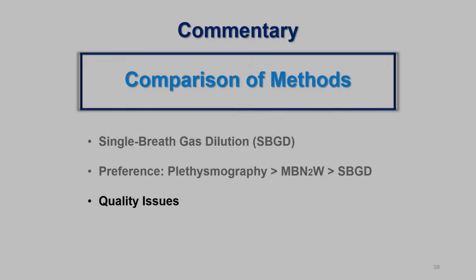Multiple breath gas dilution FRC, however, may be greater than VTG in patients who have either a finite physiologic leak, such as a tracheoesophageal fistula, or a communication with the environment, for example, a ruptured eardrum or a leaking chest tube. Again, it's incumbent on the laboratorian to have some clinical knowledge about the patient being tested.